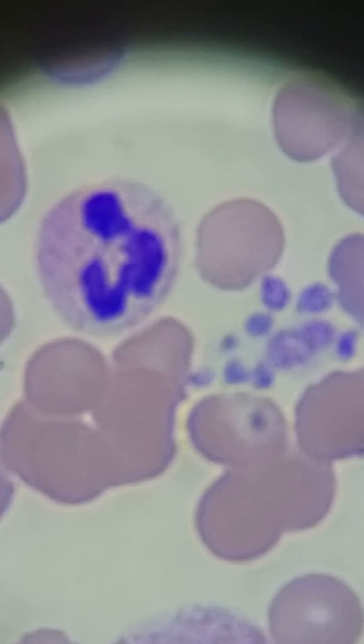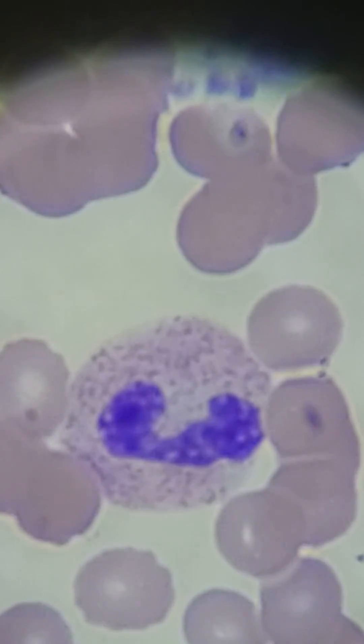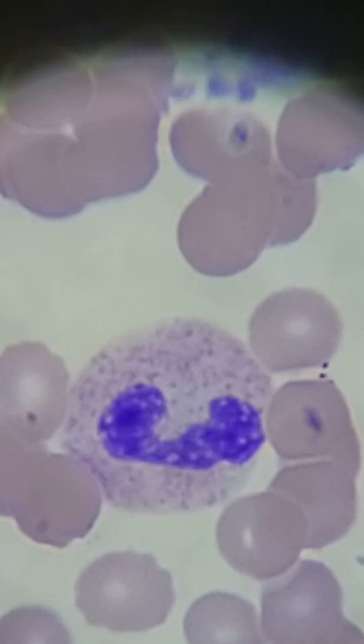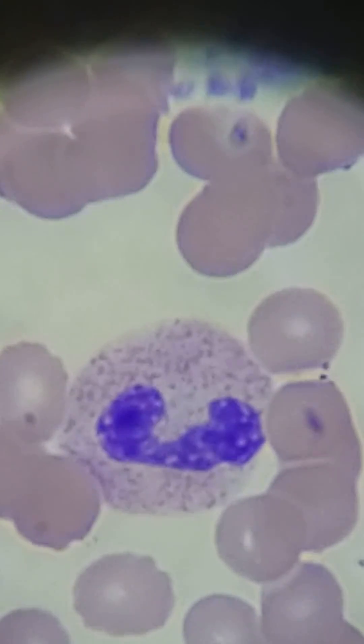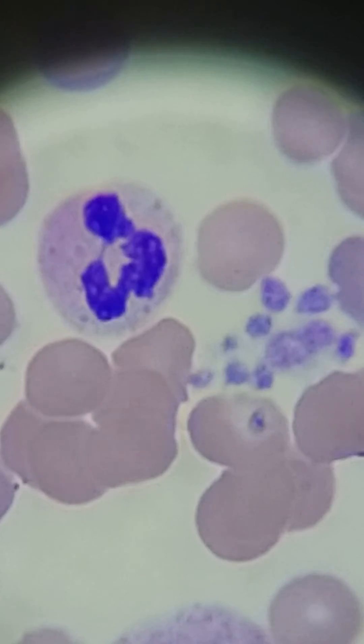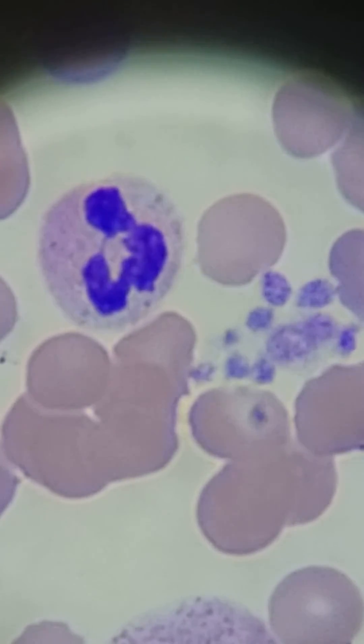It's right next to a neutrophil there on the left. And if you look down, there's a band neutrophil. You have to have chromatin that you can see in the bar part of it. It's a C or an S shape and there can't be any filament — so there is no fine filament. If you look at the one up here, there's a fine filament between those two lobes, like a string.